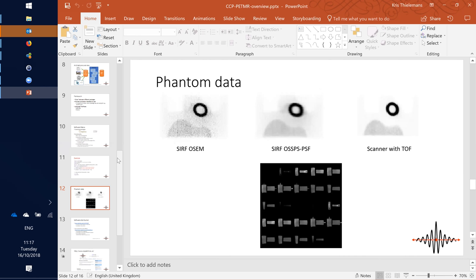Okay, and then we can read the data, and presumably have a few pre-cooked CASToR reconstruction algorithms that would write the parameter file or the relevant command line, call it, and boom, out comes the image back. You read it in. That's pretty much it, I suppose.